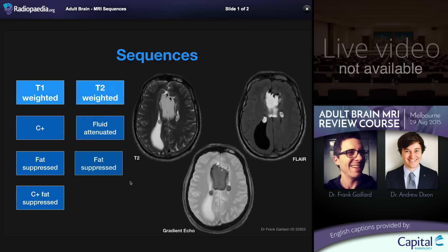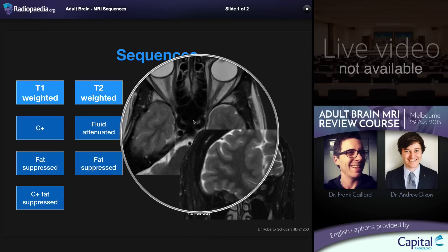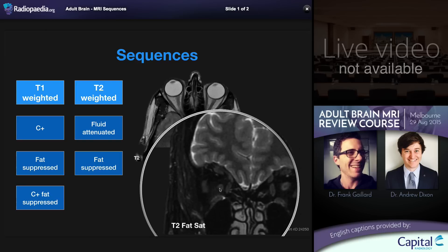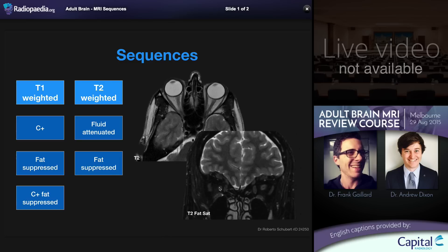Moving on to T2 weighted sequences, fat suppression can also be performed. This can be done as part of a gradient echo sequence where the intention is not particularly to fat suppress but to make it more susceptible to paramagnetic effects. More commonly it is used in the orbit or base of skull to examine structures otherwise closely related to fat — for example the extraocular muscles and optic nerve surrounded by orbital fat — making detection of abnormal signal much easier. In intracranial imaging, this would be useful for looking for a CSF leak, for example.